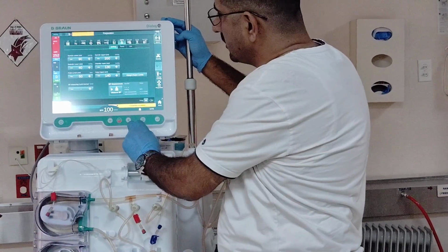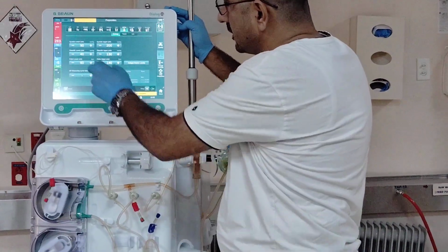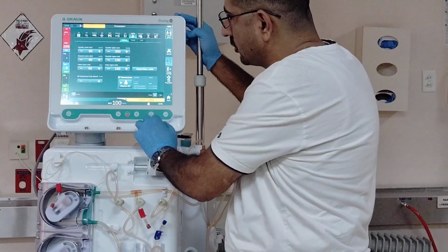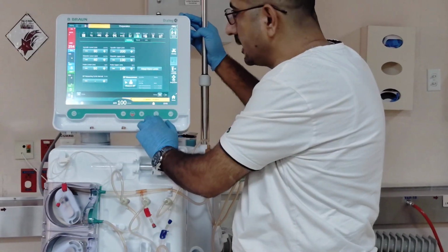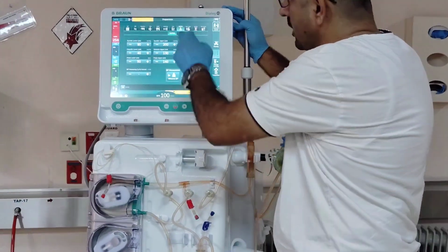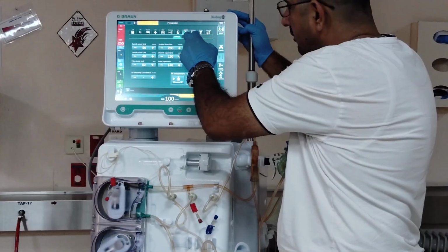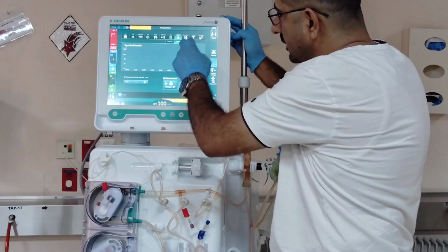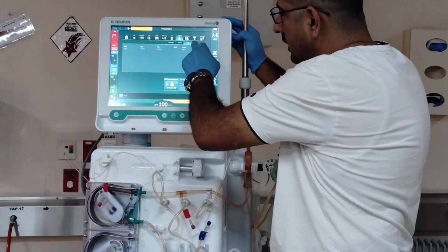For the automatic blood pressure monitoring, this is the lower and upper systolic blood pressure to set the range for the limits. And you can check the trends by pressing here. You will pick the trend, and for the list, you can choose from this.